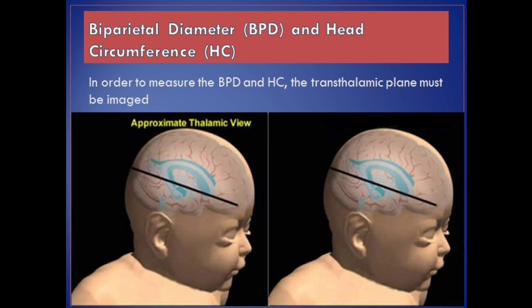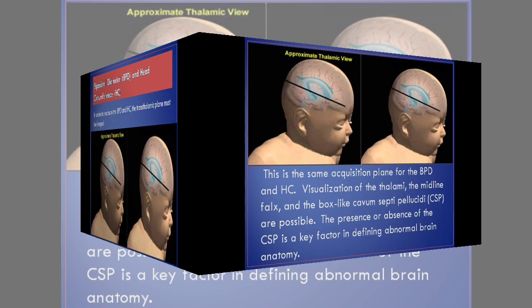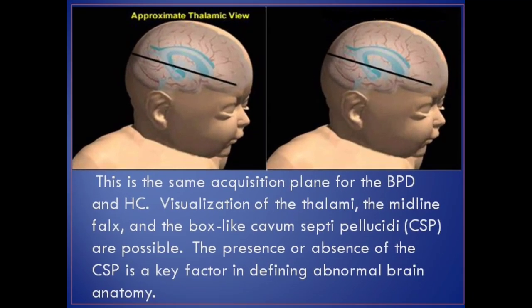Biparietal diameter and head circumference. In order to measure the BPD and HC, the transthalamic plane must be imaged. This is the same acquisition plane for the BPD and HC. Visualization of the thalami, the midline falx, and the box-like cavum septi pellucidi, CSP, are possible. The presence or absence of the CSP is a key factor in defining abnormal brain anatomy.